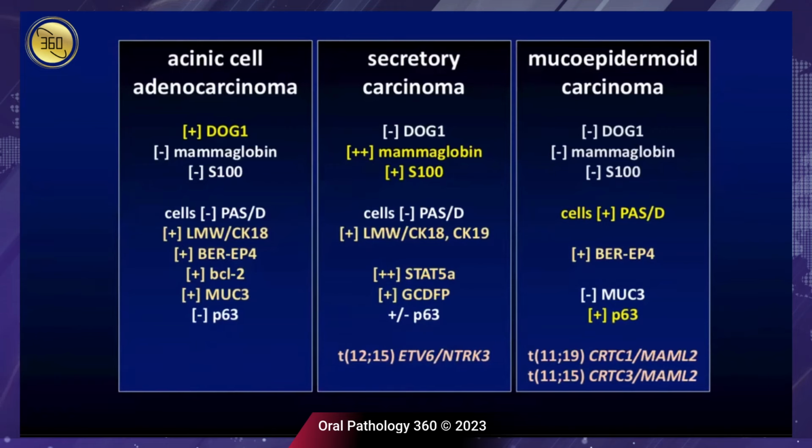So the literature is now quite ubiquitous, with a lot of things on immunohistochemistry and cytogenetics. I've highlighted, and I presented cases like this at our pathology meeting a few years ago. This was a set of cases that I thought was interesting. So when you look at acinic cell carcinomas, there's actually one immunohistochemical stain that will help you, and that's DOG1.